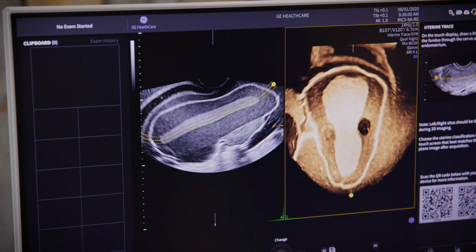larger anatomical structures. I'm Carolina, Application Specialist for GE Healthcare, and I hope you've seen how easily Uterine Trace integrates with 3D imaging into your GYN scans. Experience the difference it can make in your workflow and give it a try today.